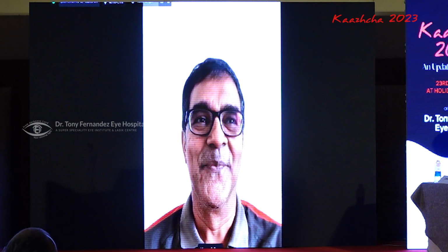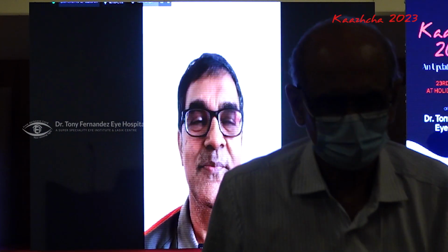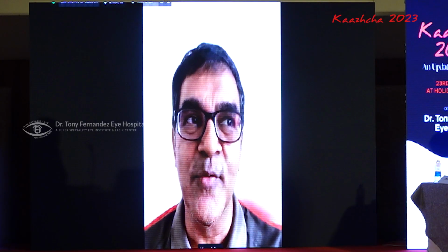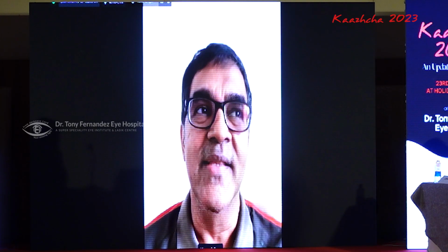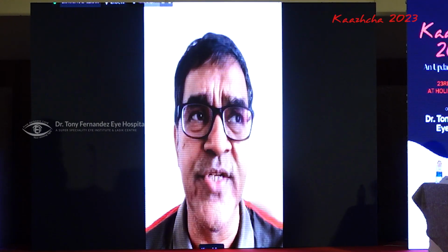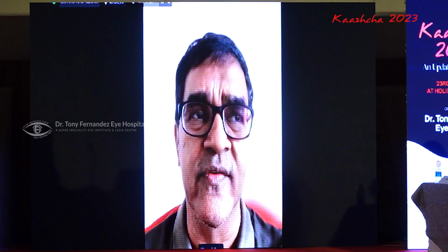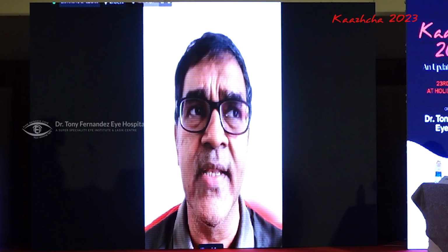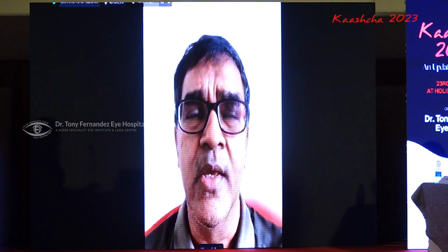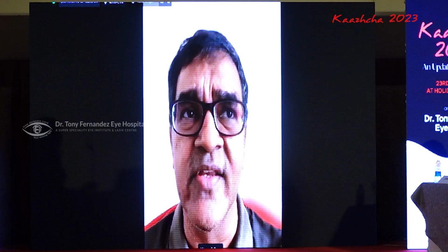Yeah, Sir, Dr. John here. Lita, do you have any comments on virtual reality perimetry? They are more comfortable for the patient, but how about the reports? You mean the headset one? Headset ones, sir. Yeah, the headset ones are fantastic actually. And we have started using it in our vision centers, peripheral centers, where we can't install these expensive machines. And I do find that if you have an established glaucoma, at least say moderate to advanced glaucoma, the field defect is easily picked up.